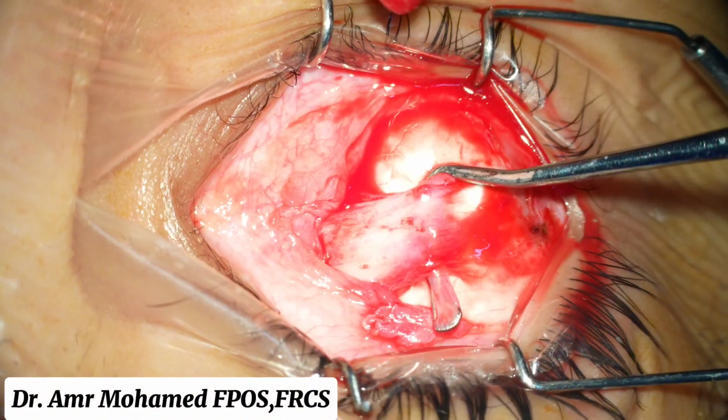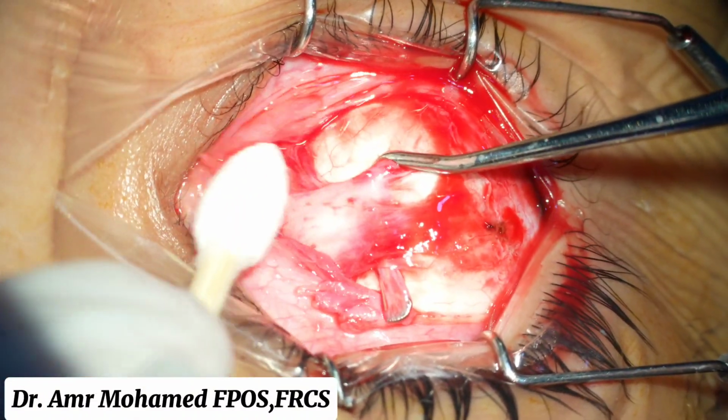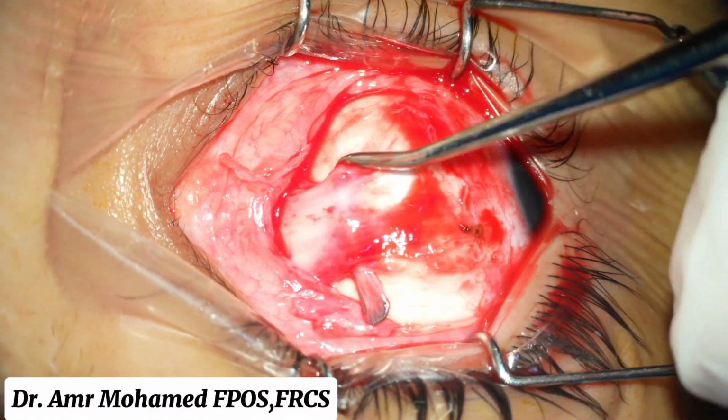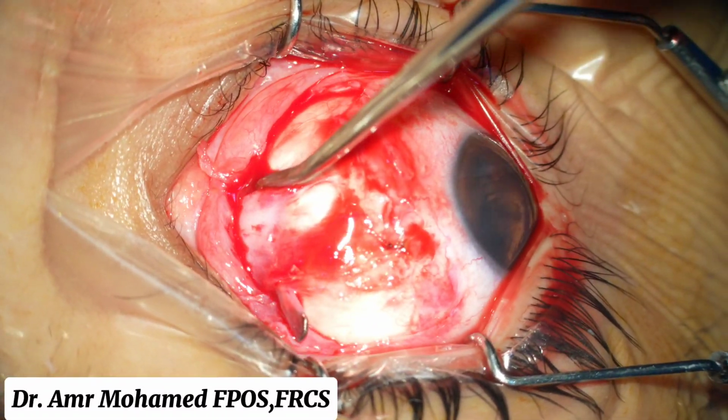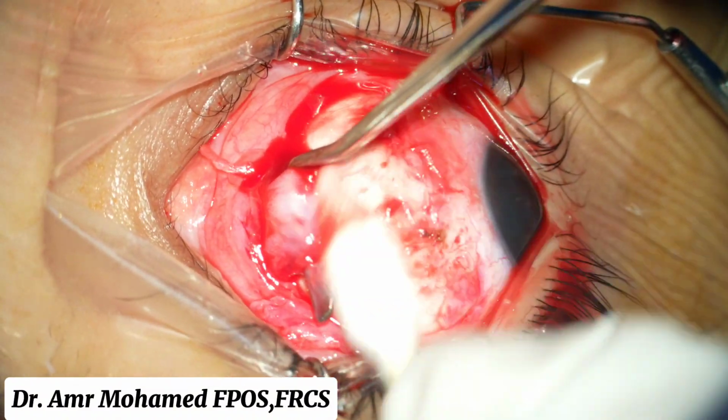In such cases, you need to do more dissection posterior from the muscle insertion to facilitate advancing the muscle after isolating the muscle with bilateral 6-0 suture.